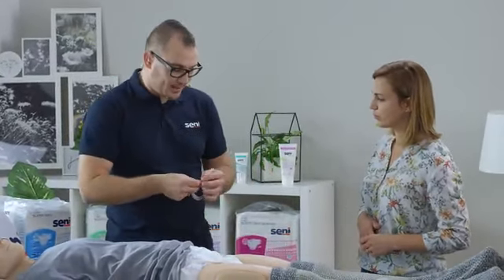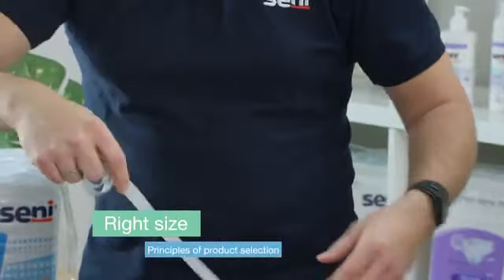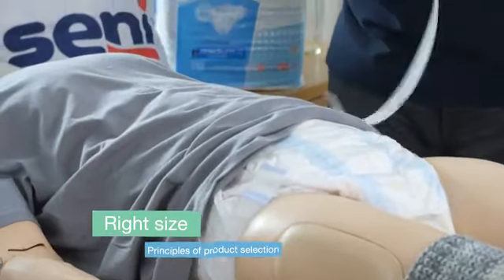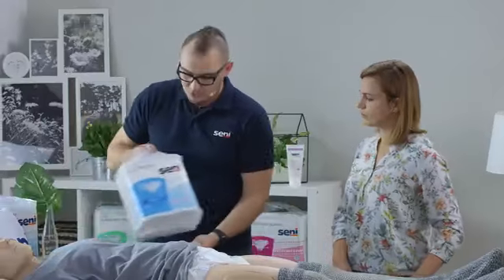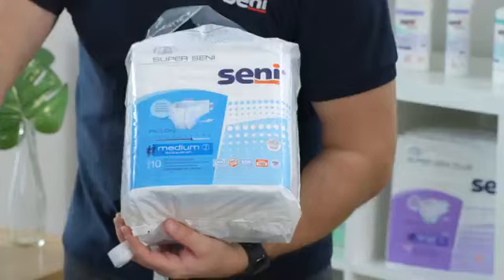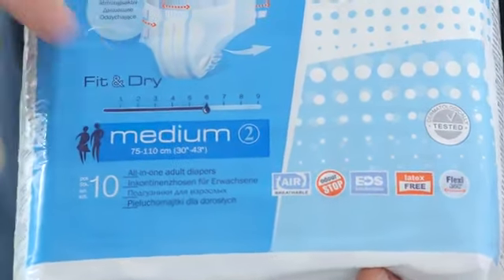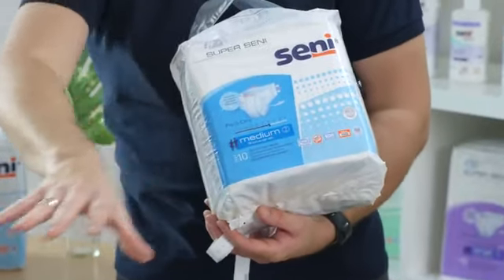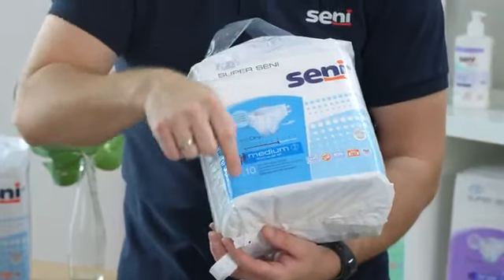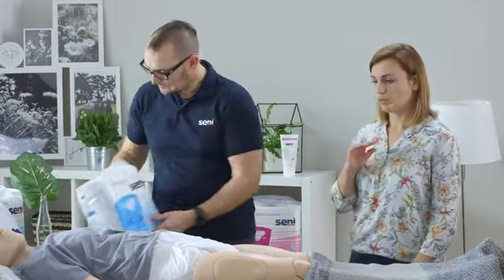The next thing is the size, and it is best to adjust it using an ordinary measure. We measure the patient in the hip and waist area and look for the right size. Again, you will find this information on each package. For example, in this case, we need the medium size, and it is from 75 to 110 centimeters. It is best if 2 sizes fall into this range, but in certain situations, there may be only 1. And then we look at this larger range and see which of the larger ranges suits us for this suggested circumference.